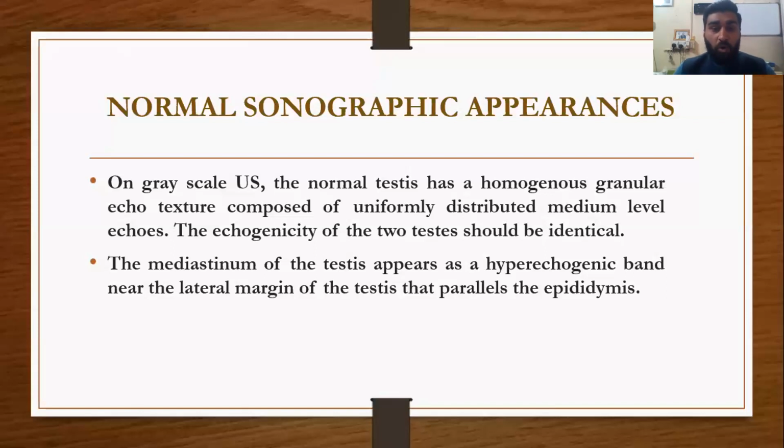The mediastinum of the testis appears as a hyperechogenic band near the lateral margin of the testis that parallels the epididymis.